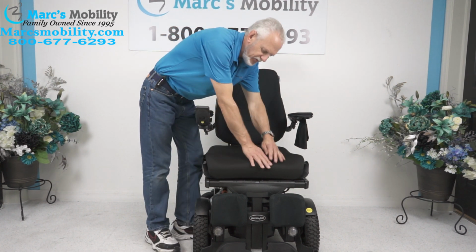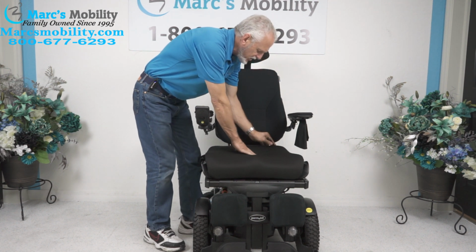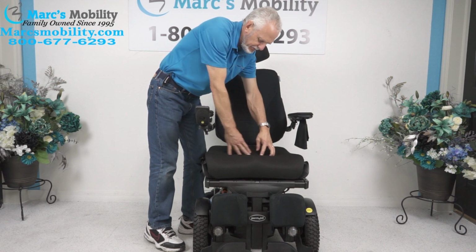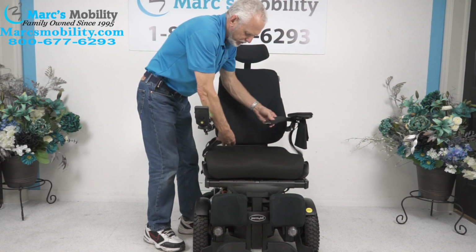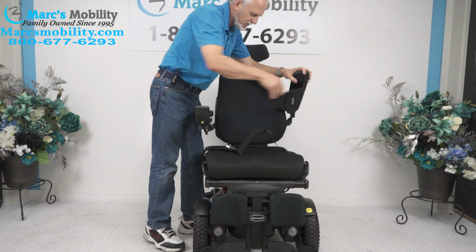This is a foam in the front, contour foam in the front, and air in the back. This is all air. There's actually a valve right here. You can see it right there. You can pump air in this valve. You can fill the bottom part of it right here. That actually needs air right now. You can fill it up with air. There's also your Permobil safety belt. You've also got a Permobil bag right here.